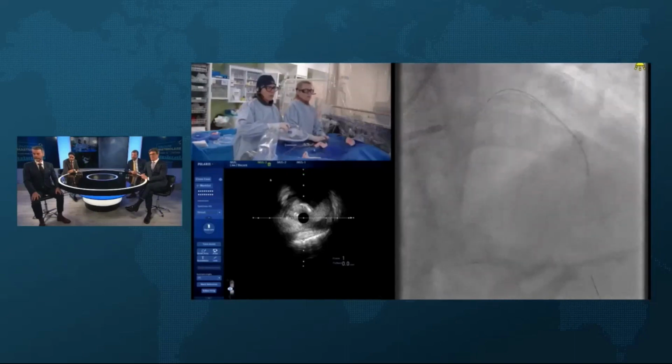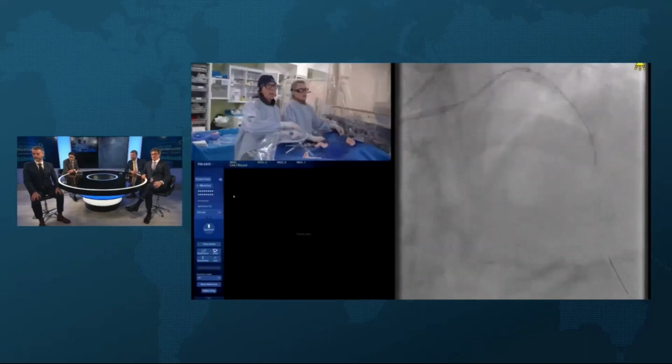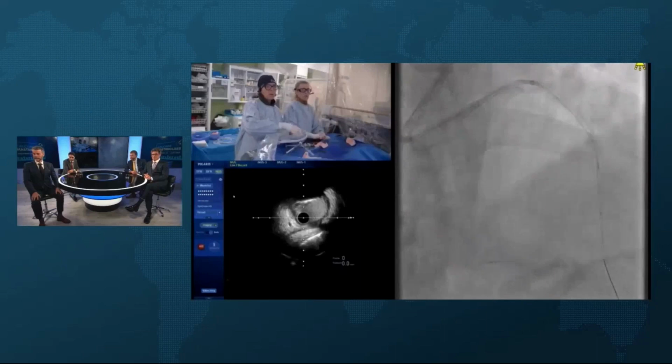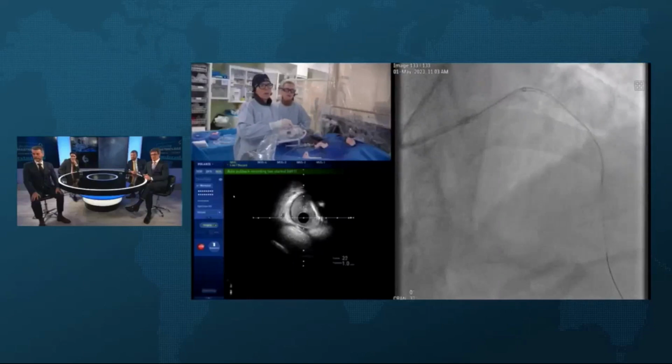And I always like to talk about what-ifs with cases because I think they're really instructive. Let's say somebody couldn't have gotten the IVL down from the IVUS and we had to do atherectomy. Anybody have any issues with that? Very nice. Yeah, let's go there. Stop looking any further.